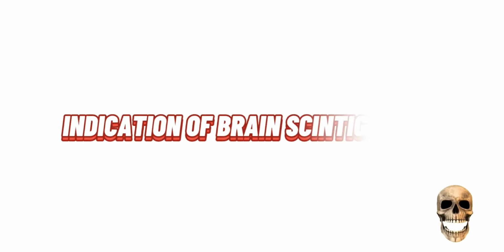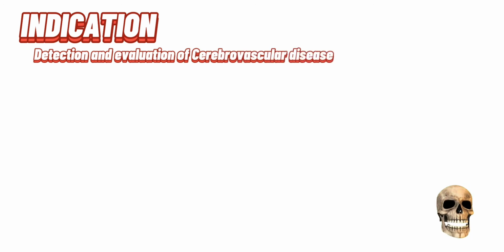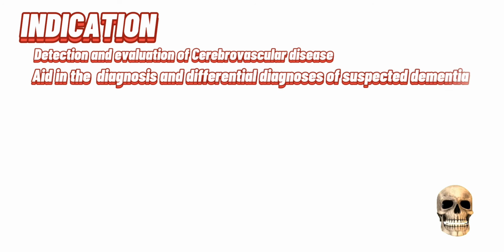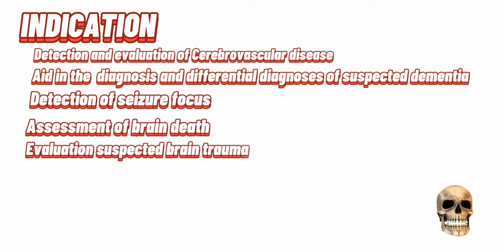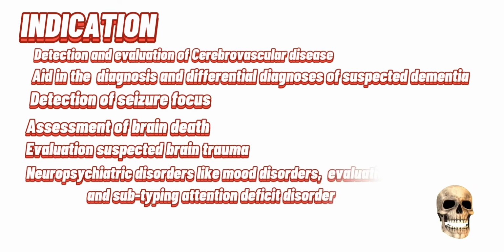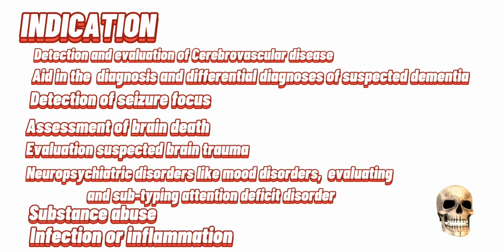The indications of brain scintigraphy. Detection and evaluation of cerebrovascular disease. Aid in the diagnosis and differential diagnosis of suspected dementia. Detection of seizure focus. Assessment of brain death. Evaluation of suspected brain trauma. Neuropsychiatric disorders like mood disorder, evaluating and subtyping attention deficit disorder. Substance abuse, infection or inflammation.